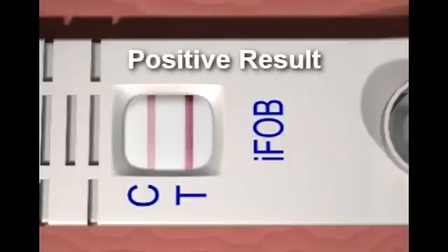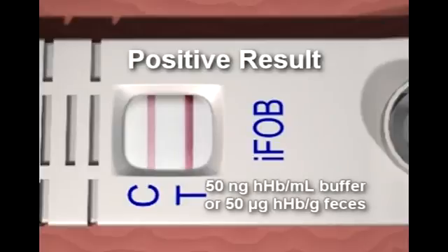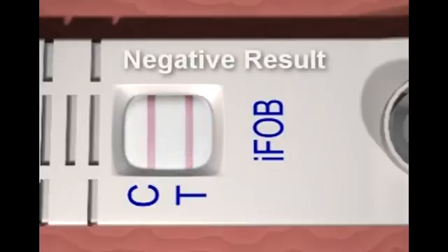Positive result. If both a control line and a test line are present, the result is positive. A positive result indicates the level of human hemoglobin in the specimen is at or above the detection level, 50 nanograms of human hemoglobin per milliliter buffer, or 50 micrograms of human hemoglobin per gram of feces. Any intensity of a burgundy-colored test line is considered a positive result.